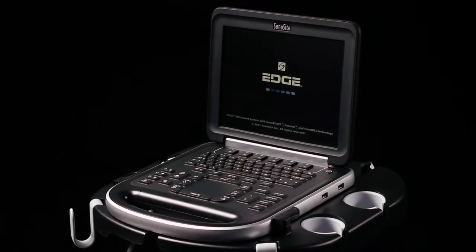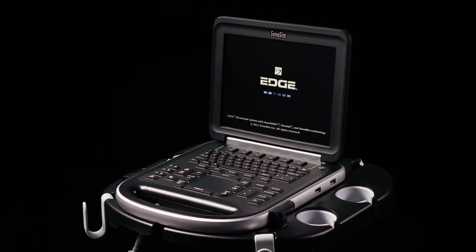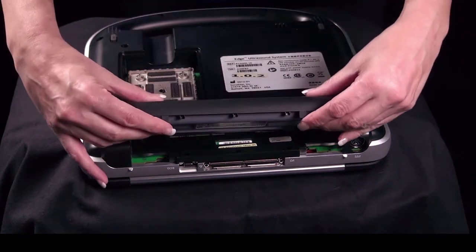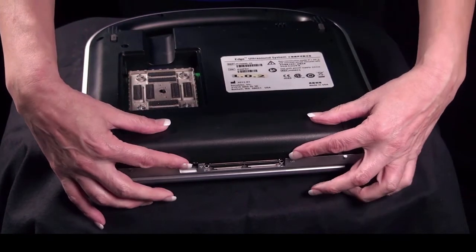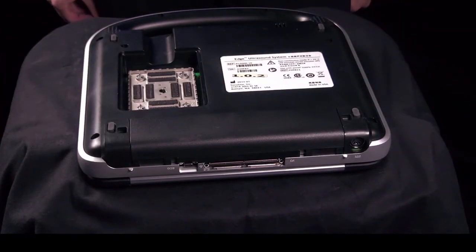The Edge operates efficiently on either AC or battery power. You install the battery with the system upside down. Slide the battery into the battery compartment, then slide the two locking levers out to secure the battery. If the battery is being installed for the first time, it will need to be charged.